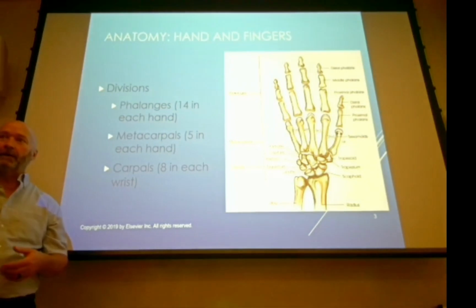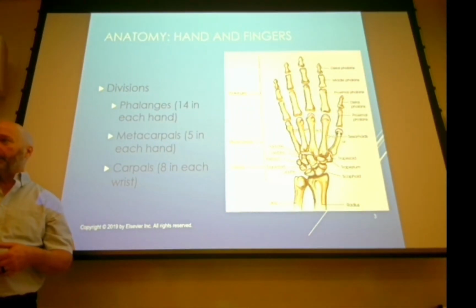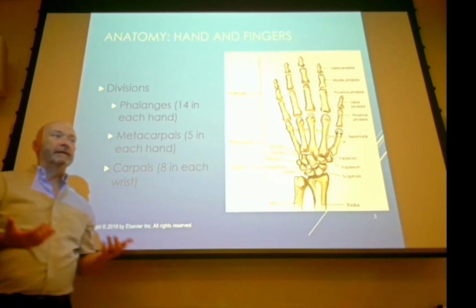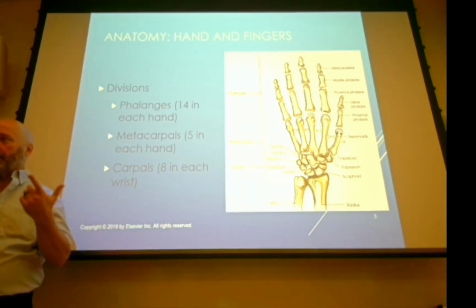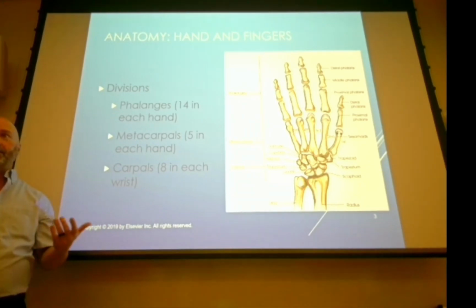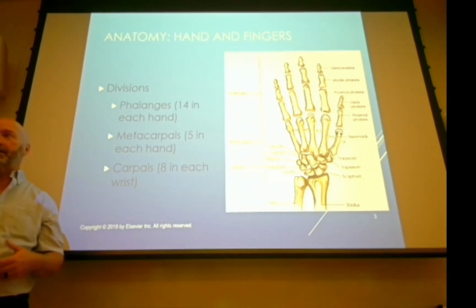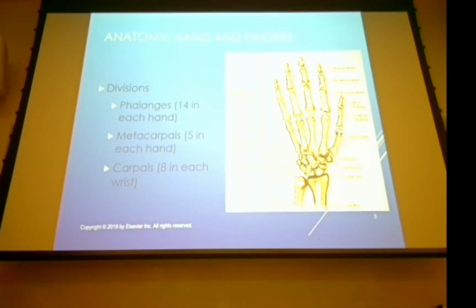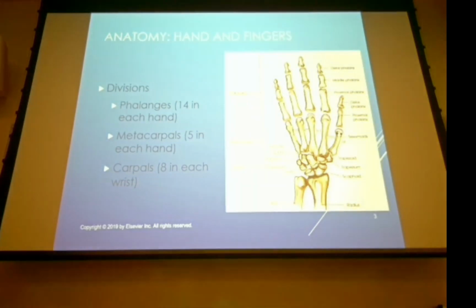Where are you going to put the central ray? Middle of the anatomy. Now pick out the middle of the anatomy, right? It's really not rocket science, as long as you don't overcomplicate it and you just kind of look at it from a logical standpoint. The things aren't as complicated as what Merrill's makes it out to be. But we do have to know the technical names of everything.